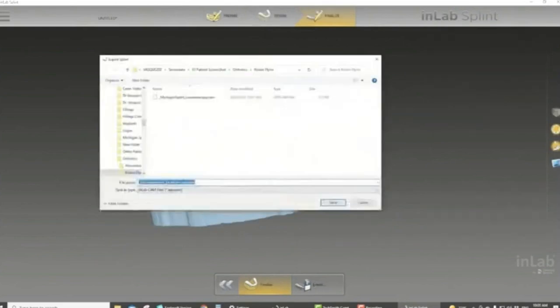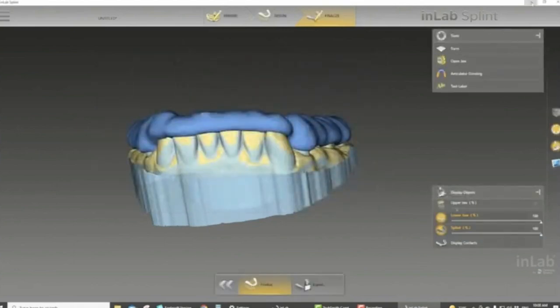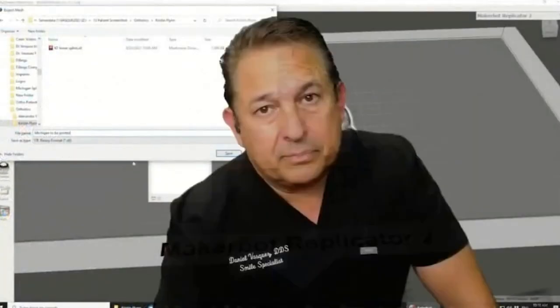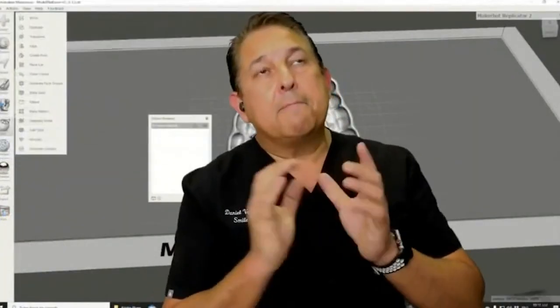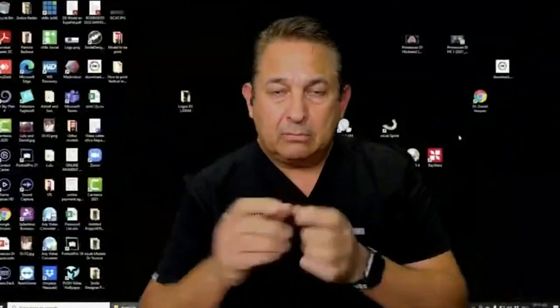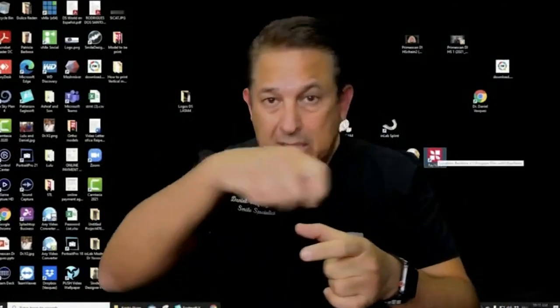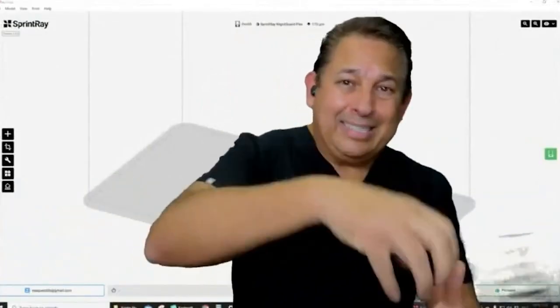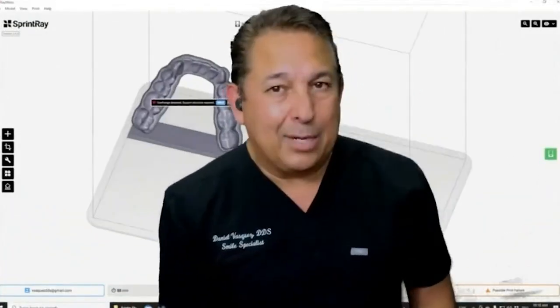I know I'm talking about printed single restorations, but I think if you're able to offer other services, you'd be happier than anybody. Because to do a temporary crown, you have to numb, cut, prep, take an impression, send it to the lab, send it to yourself, mill it, print it, deliver it, correct? It's a lot of work.